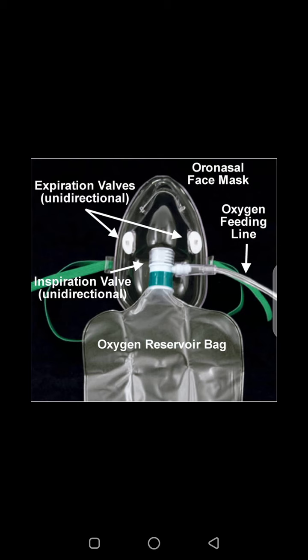Another valve is the inspiratory valve. The inspiratory valve here is also a unidirectional valve. But unlike the expiratory valve, it only opens when the patient inspires or inhales air.